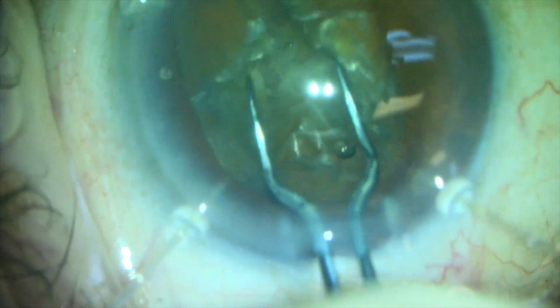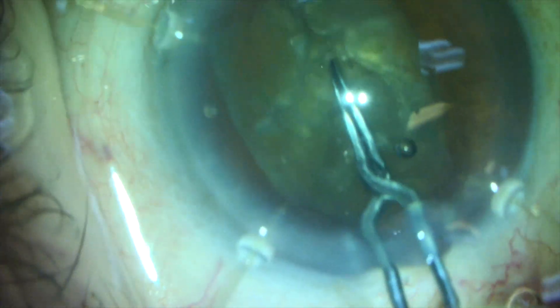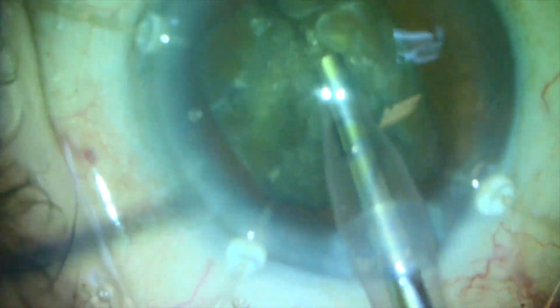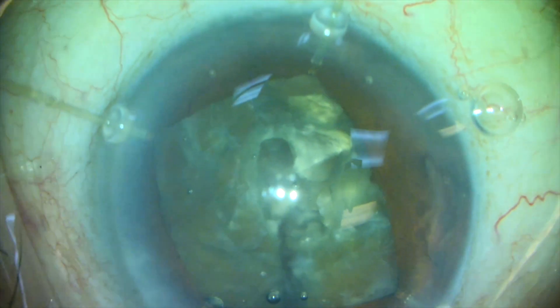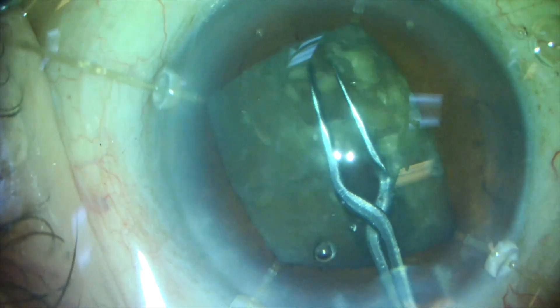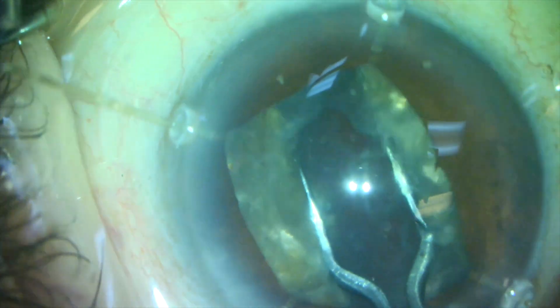You can see it creates a split of the nucleus that's not all the way through. We then push the pre-chopper further toward the retina, further toward the posterior capsule, and spread it again. We continue that motion until we can see that we've broken through the posterior plate. We then rotate the lens 180 degrees, advance the groove just a little bit, refill the eye with viscoelastic, and reintroduce the Inamura pre-chopper, pushing toward the posterior surface of the cataract. Each time we expand the pre-chopper, we're able to advance it further toward the posterior plate, which we eventually break through.